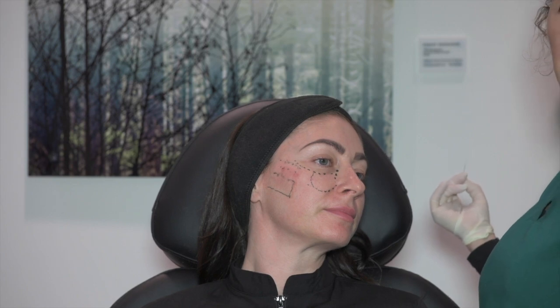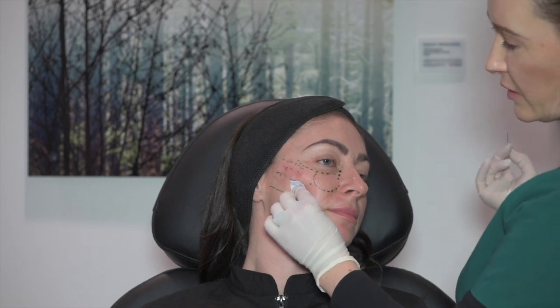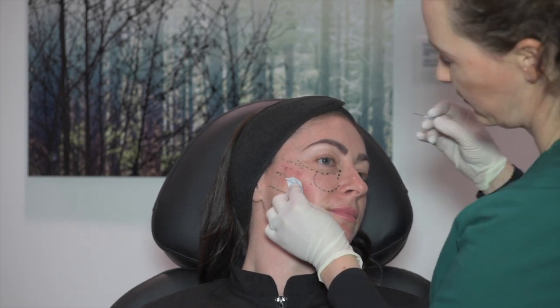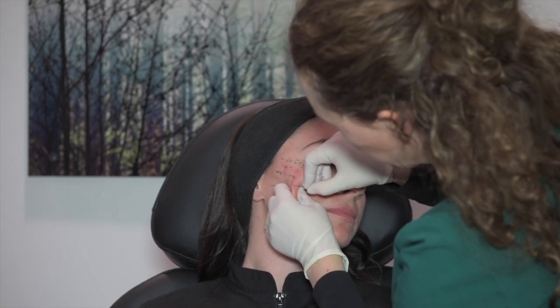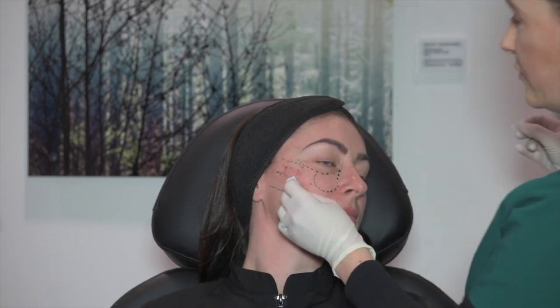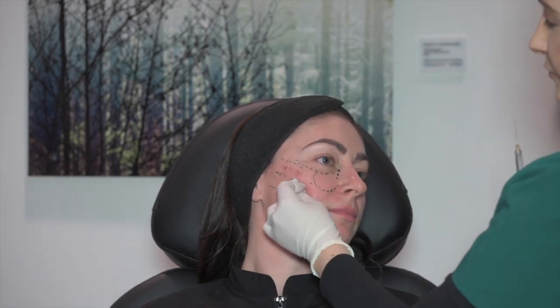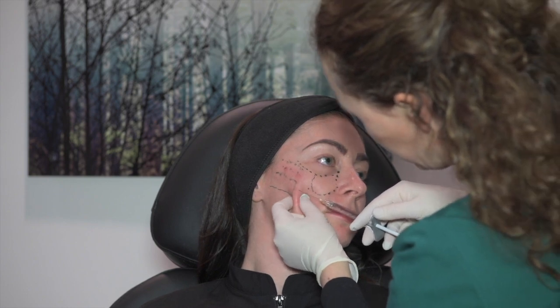CK4 will be with 0.5 mils of Voluma via cannula in the subcutaneous plane. So we clean, needle entry point, pinch, add my Voluma on cannula, and then we inject 0.5 mils in the subcutaneous plane.